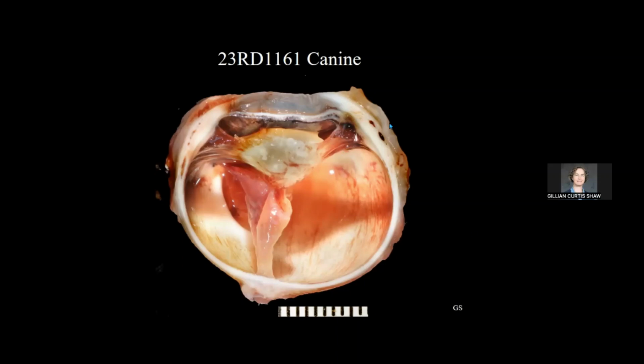What we have here, we did not sample through the pupil, but here's the iris up here. One thing right off the bat you can note is how poorly pigmented this uvea is. There's very little pigment in the iris stroma, and the entire choroid is poorly pigmented. This was no doubt a blue iris, which they did tell us as well. Here's the lens, and it's quite cataractous. It's a little bit shrunken, so we'll take a look at that. And here's the retina, and it is detached.